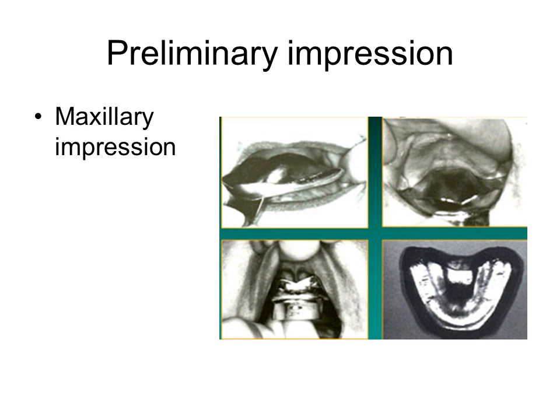The tray is tried in and adjusted similar to the mandibular tray. It is necessary that the tray cover the tuberosities, hamular notch, and vibrating line. The tray is rotated into the mouth, and the posterior extent is inspected. Ask the patient to close slightly. The labial vestibule is visualized. Use red wax to extend the tray, support the alginate, confine the material, and help adapt the tray to the borders.